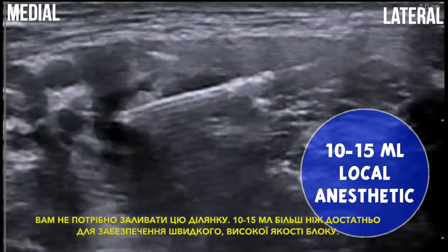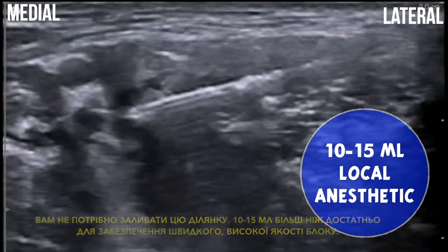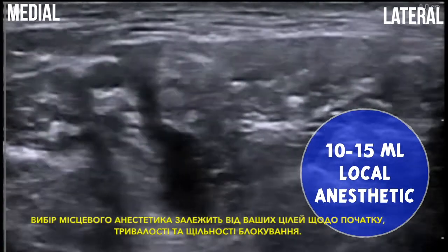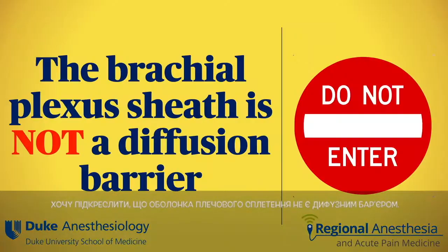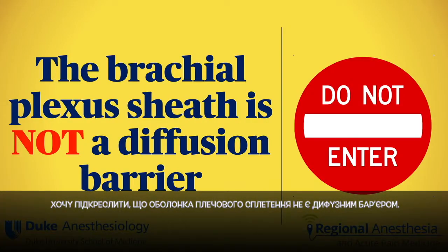You don't have to flood this area — 10 to 15 mils are more than enough to ensure a quick onset, high quality block. The choice of local anesthetic obviously depends on your goals for onset, duration, and block density.